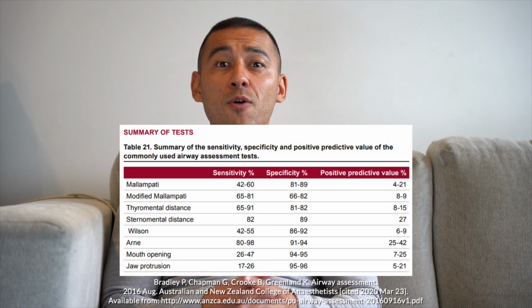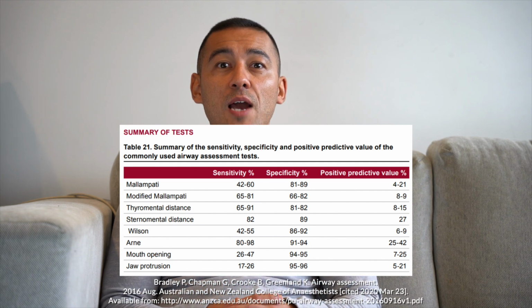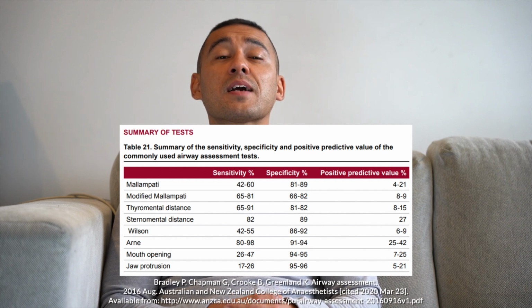Despite the obvious benefits, airway assessments still have limitations and implications. Firstly, it may not be possible to perform some of the assessments in the pre-hospital setting because of reduced GCS and compliance. Secondly, the individual airway assessments, even when used collectively, are not 100% sensitive or specific and will therefore incorrectly suggest that an airway might be easy or hard when it is in fact the opposite. Thirdly, the dangers of taking excessive time to perform each of the 4 mnemonics of LEMON, MOANS, RODS, and SMART needs to be weighed up against the dangers of not performing them at all.